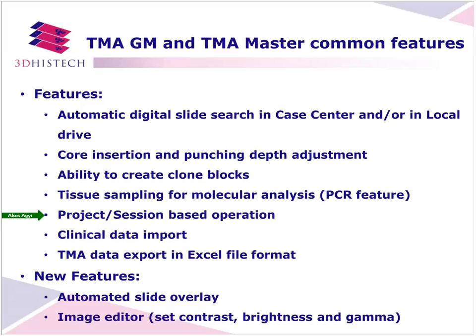In both systems, the users can import clinical data to the TMA database. This clinical data will be automatically merged with the TMA data during the export process through the donor block IDs. Our TMA systems are able to export the TMA data in Excel file format.